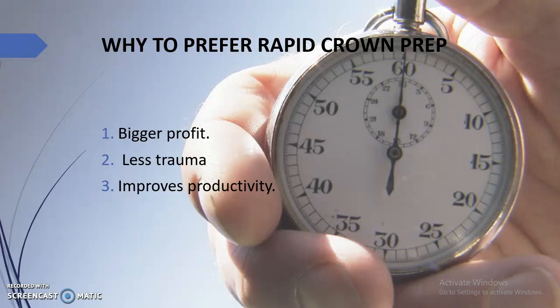Why prefer rapid crown prep? If I say rapid crown prep, it doesn't mean that I'm fixing my time for the prep. It means I am actually giving less time to prevent trauma to the pulp. I'm trying to maintain the health of the pulp.